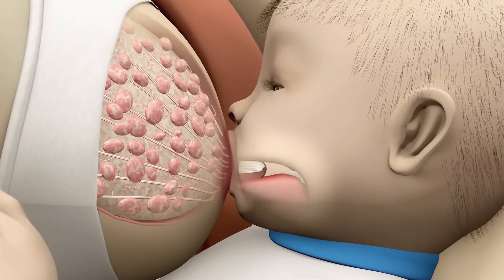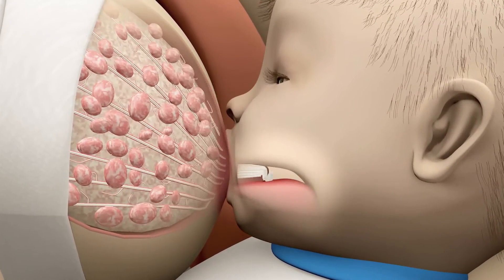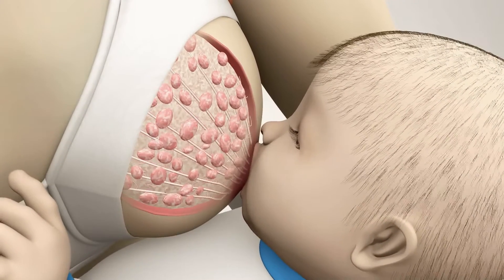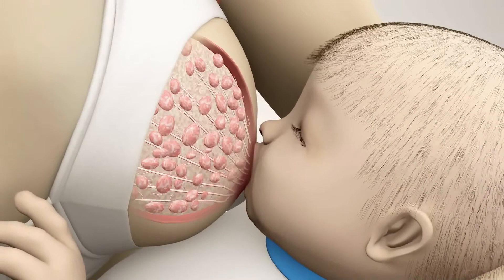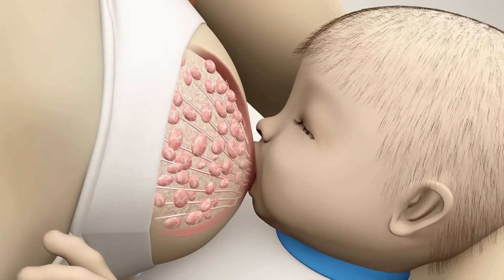Now the milk will start to flow. Usually this happens in less than one minute from the start of the feed. The baby changes to a slower sucking frequency of around one suck per second. This is nutritive sucking, or the expression phase.